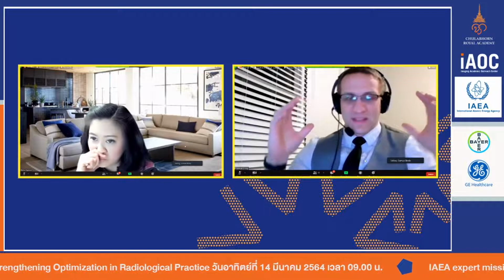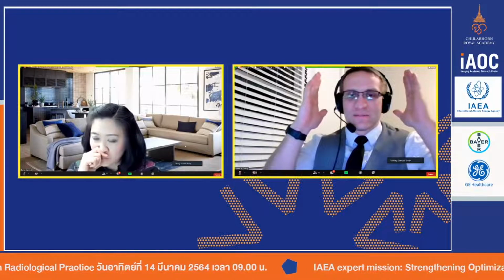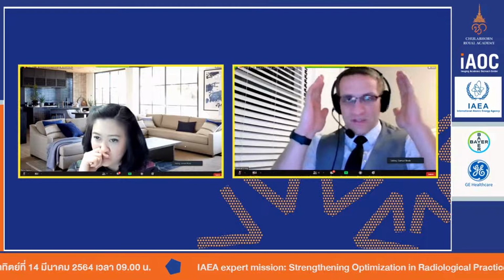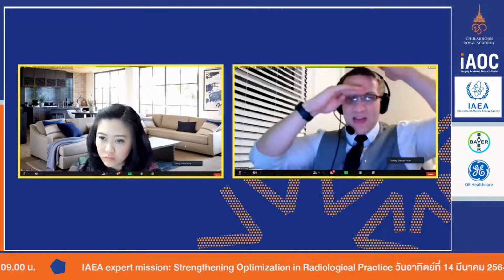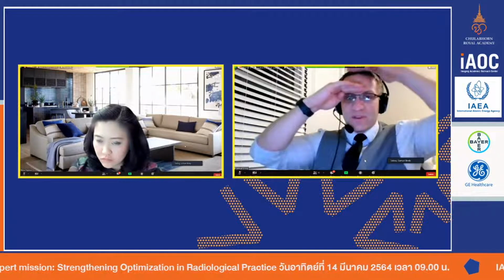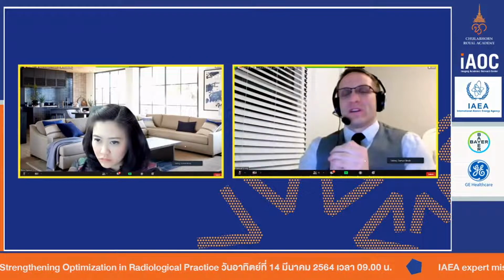So when I talk about the scan field of view, when you think of it in the sense of setting it so you can optimize the pixel depth or the pixel width. So you've done the scout, and you've set where you want to do the beam width. And as for the scan field of view itself, I should be very clear.